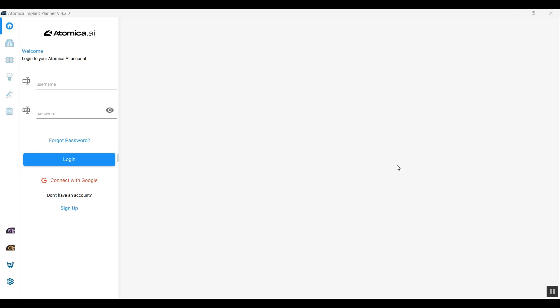Hello and welcome to this video. Today I'll be demonstrating how we can plan and design a surgical guide using Atomica software suite from start to finish, starting with planning using the Atomica Implant Planner and moving to designing our surgical guide using the Atomica Guide Design.